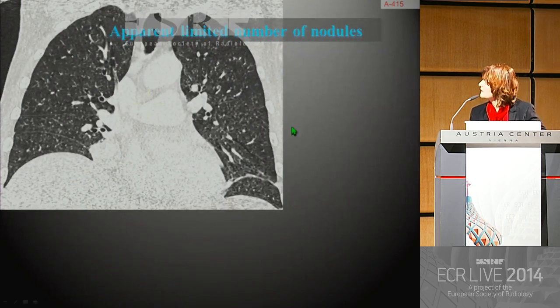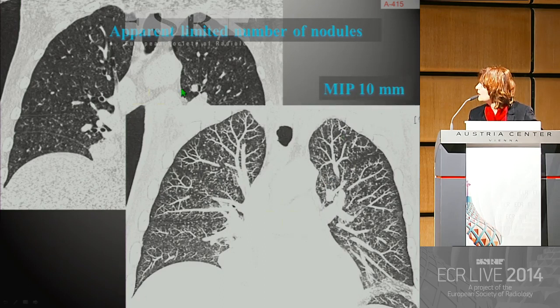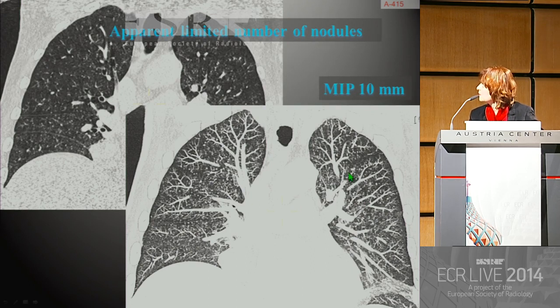Faced with an apparently limited number of nodules, there is a great added value of maximum intensity projection. You can see here the widespread distribution of these micronodules with random distribution, characteristic of hematogenous dissemination in miliary disease.